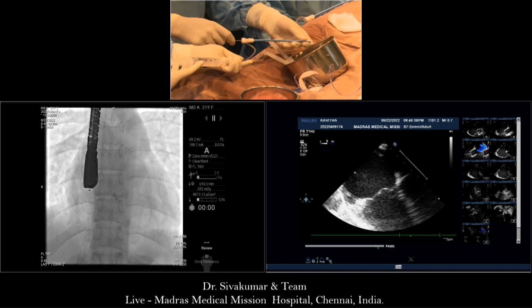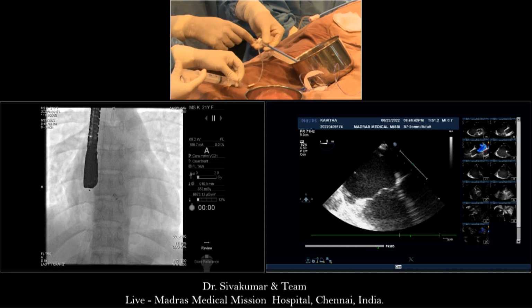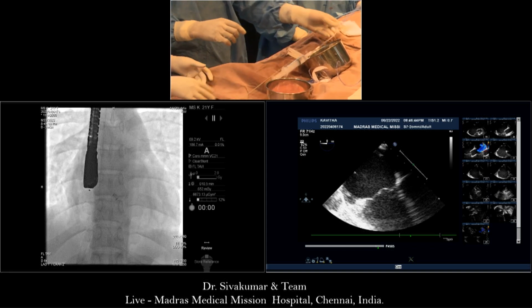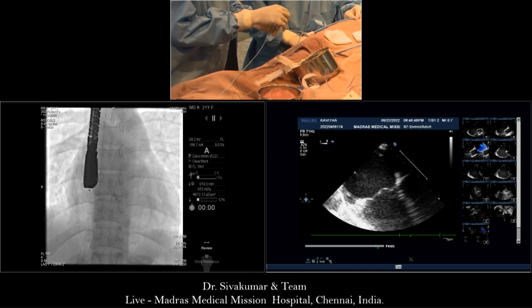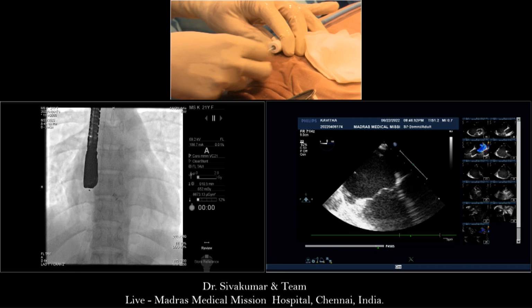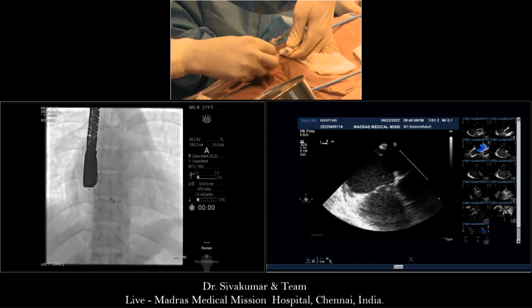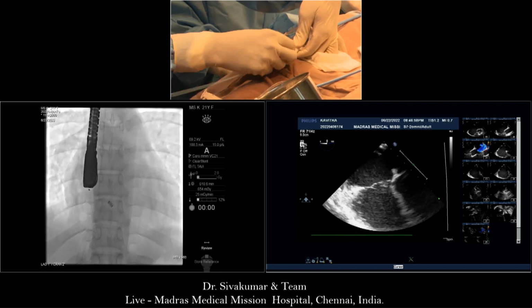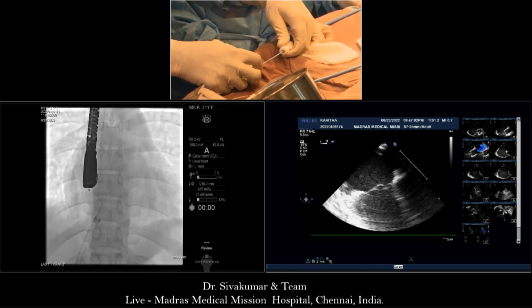So that 36, was it fine? One says fine. Any other fines apart from these two? Was it too small? Hands up for too small. Hands up for I'm too tired, I don't want to know anymore. Okay, right. Shiva, don't rush. You take your time. We're going to look at this beautiful result. Let's not distract him too much now.